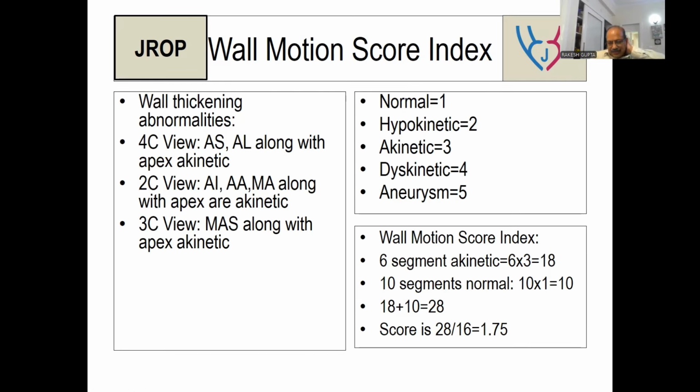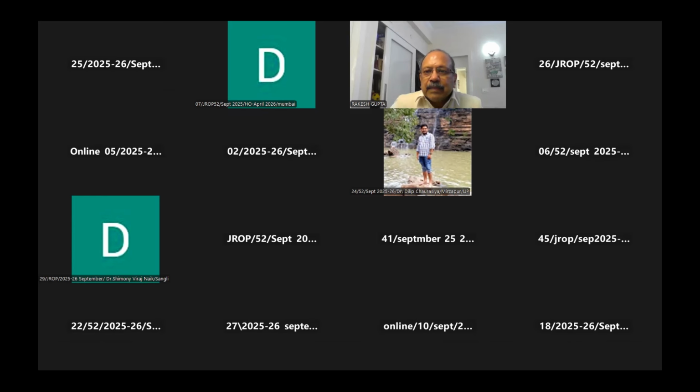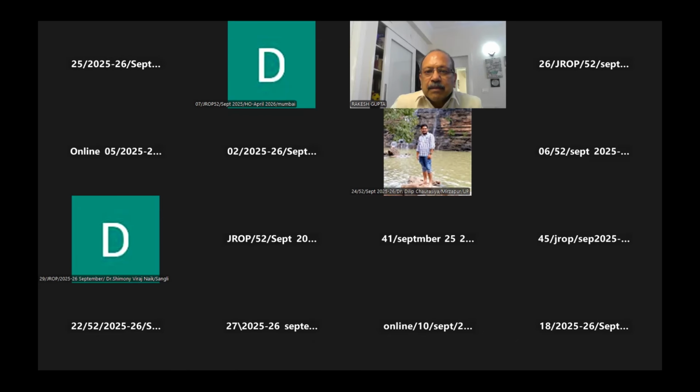Correct. And based on this score, we really prognosticate. Allow me a second. I'll show you how we prognosticate subjects. Just a minute. Everything has got certain definite values of evaluations.